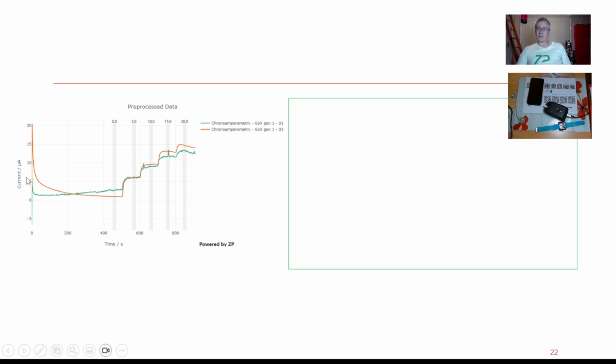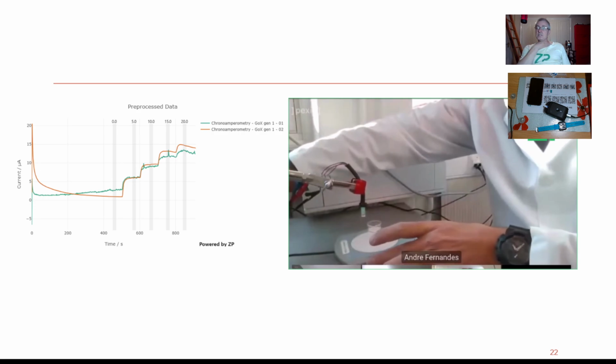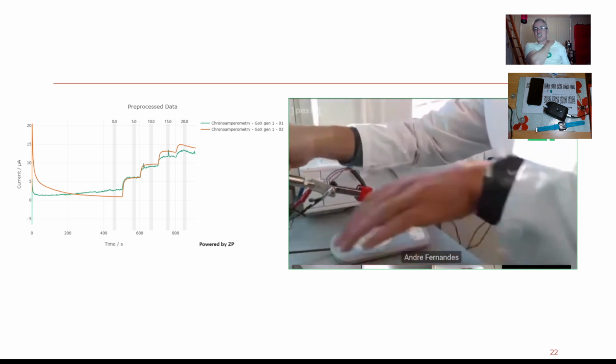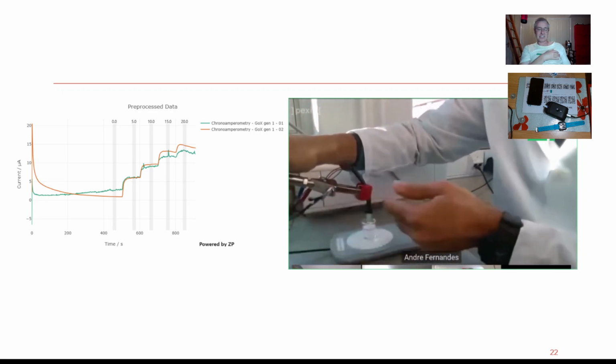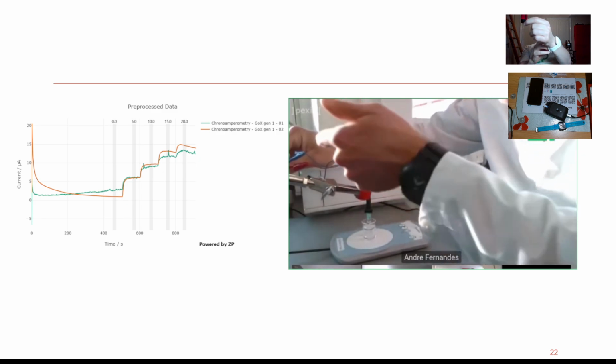So when I said you're not showing me raw signal, you're showing me an extraction of raw signal. This will be the kind of raw signal that, if Zimmer Peacock was testing a glucose sensor, we call it a staircase experiment. In fact, I'll get Andre, and I really respect Andre. He is just setting up quite a simple experiment with one of our CGM sensors, but it's based on a screen printed electrode. So it's more like a planar CGM. It's not a microneedle in the same vein that this is a microneedle. I'll just flip this out.